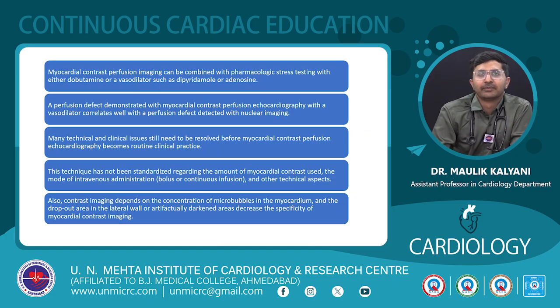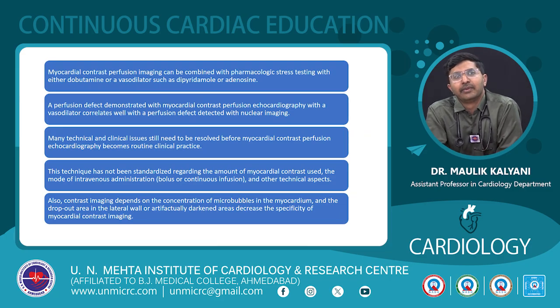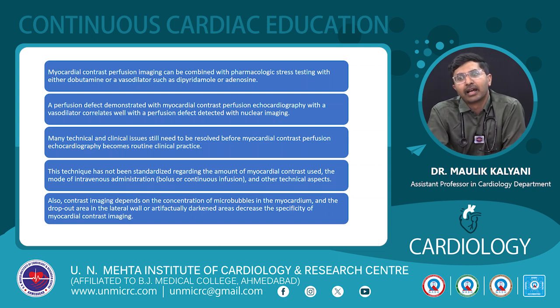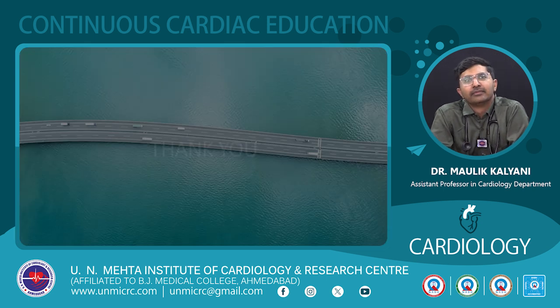From a future perspective, if there were contrast agents that are widely available and cheaper, we might routinely use this kind of imaging instead of cardiac MRI or other imaging to rapidly evaluate viability and other things. So overall, whatever we have discussed about left ventricular contrast is generally more of a theoretical discussion, because we are not generally using contrast in left-sided heart chambers in day-to-day clinical practice. But saline bubble contrast in the right-sided chambers is very useful. In selected cases, it might give you the diagnosis even though all the other imaging modalities have failed to do so. Thank you.